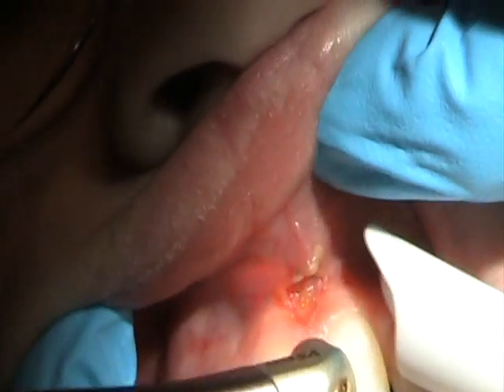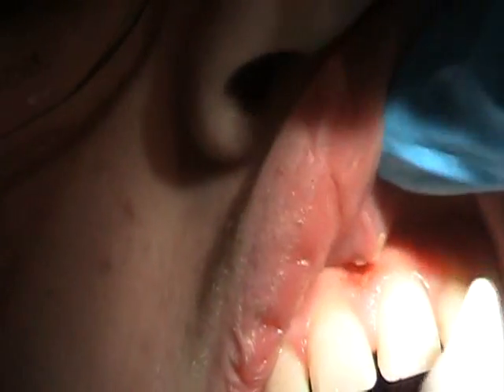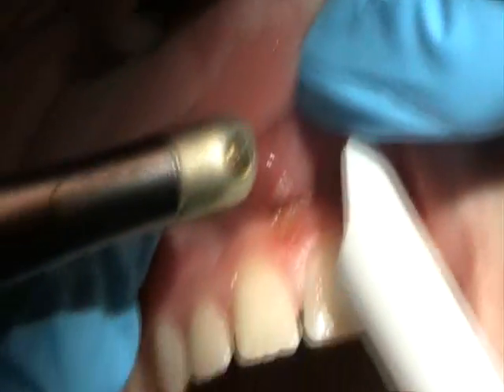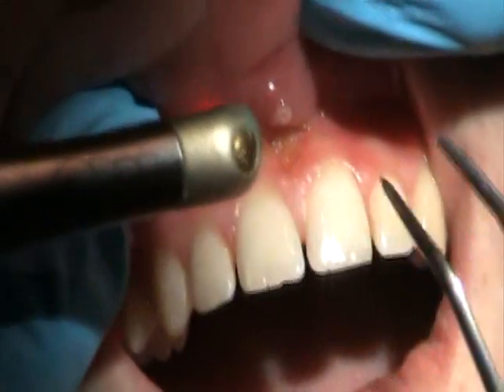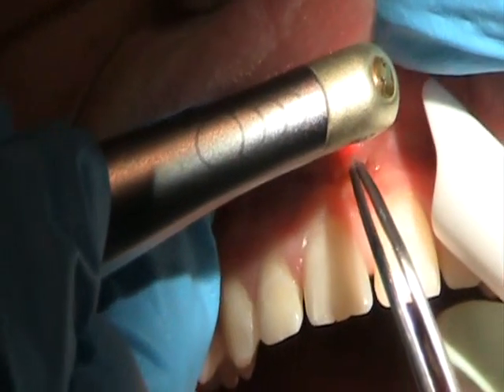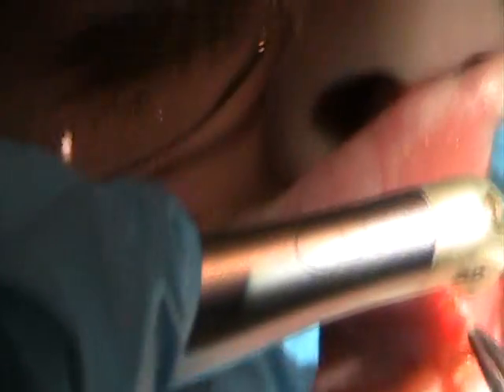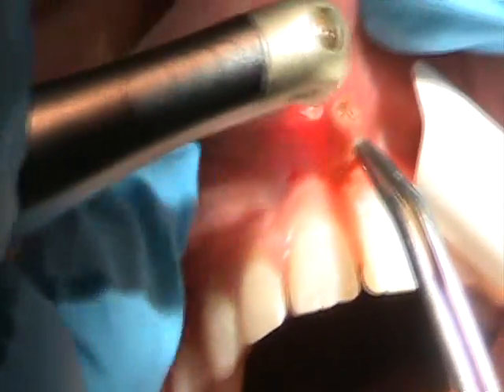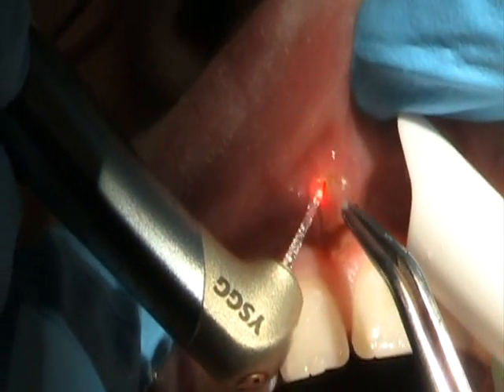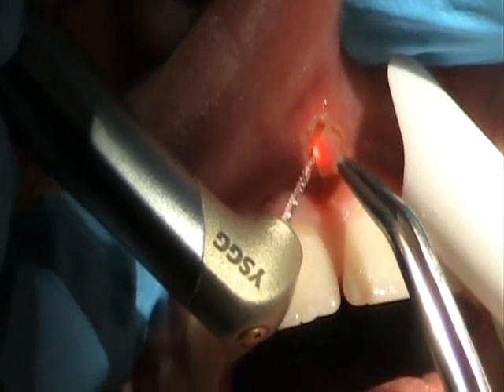You don't have to follow it up into the lid. We're going to come back now. Okay, I'm going to have to pick up, and you're going to grab this little part right there. You want that tissue just to melt away. Very slow, back and forth.